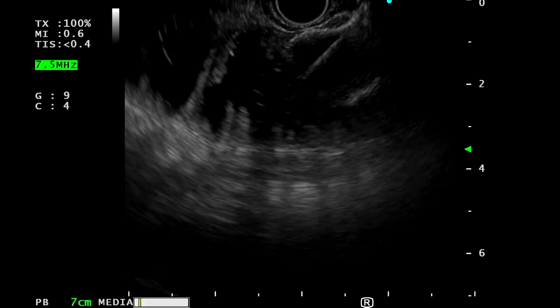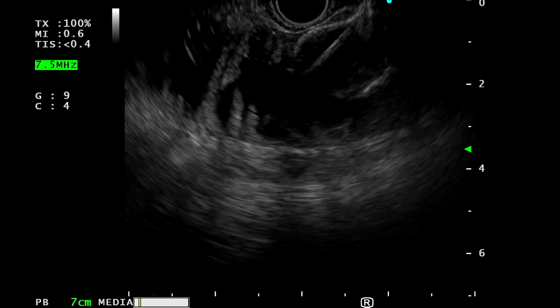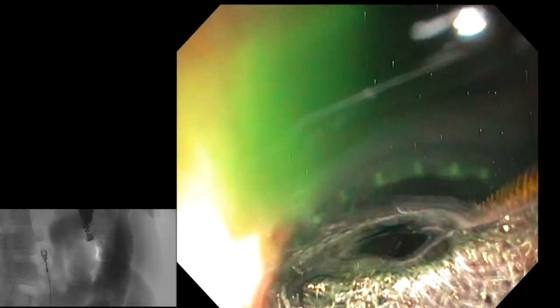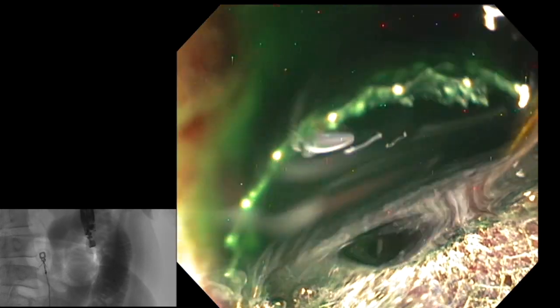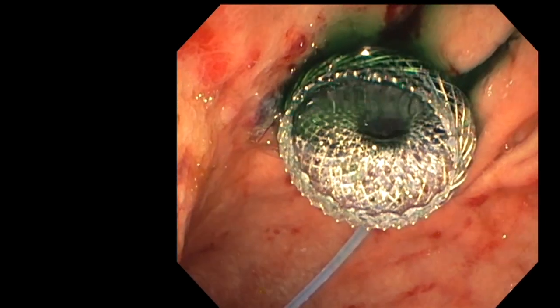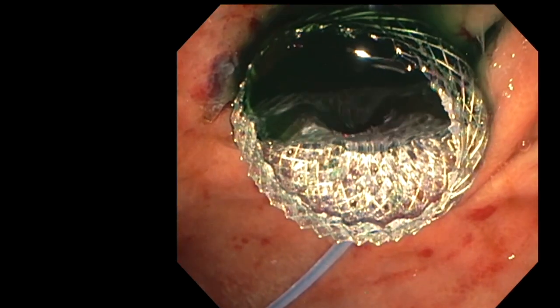The proximal flange is deployed within the channel of the echoendoscope rather than looking for a black mark, and then pushed out into the gastric lumen after deployment within the channel. Correct placement of the stent is confirmed by free flow of saline mixed with methylene blue into the gastric lumen.